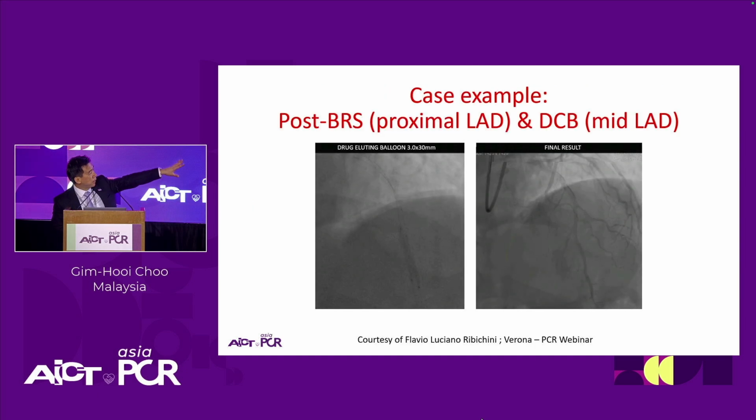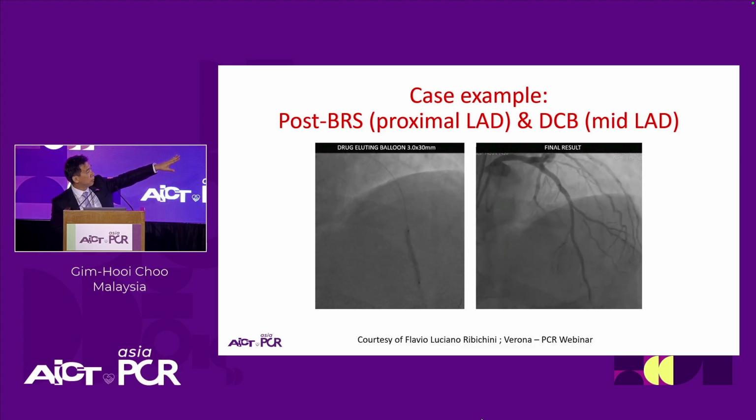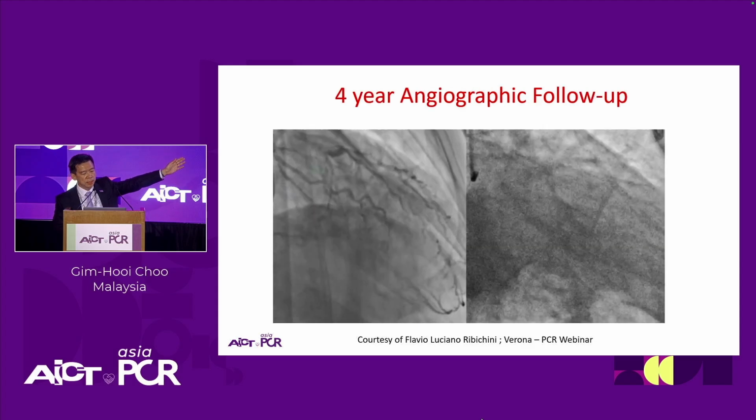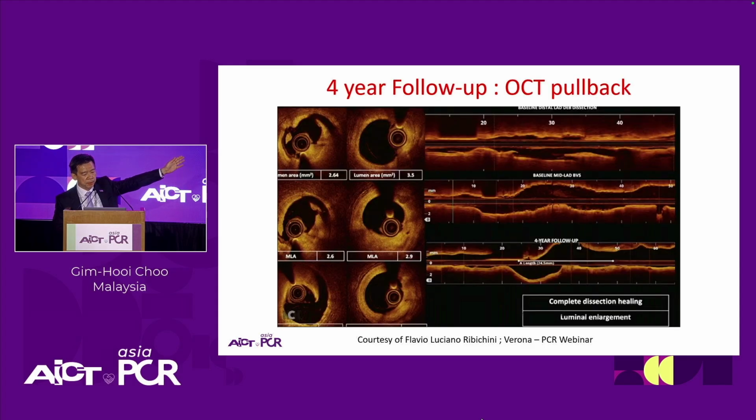Here is the case, not for me, but Dr. Flavio. You see the result after DCB, good results, but on OCT, look at that kind of ghastly dissections. Many of us who have been taught to do stents would put in a stent because of the deep media dissections. 4 years later, the vessel healed, and on repeat follow-up, the dissections actually heal. 90% of dissections heal.